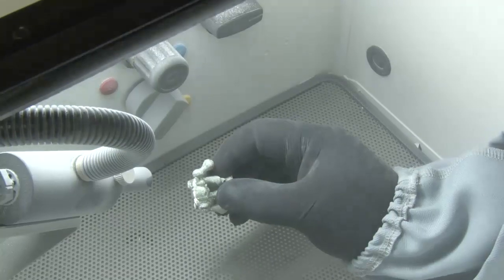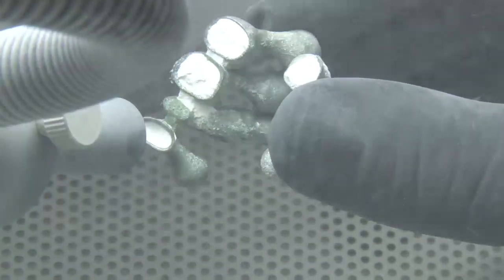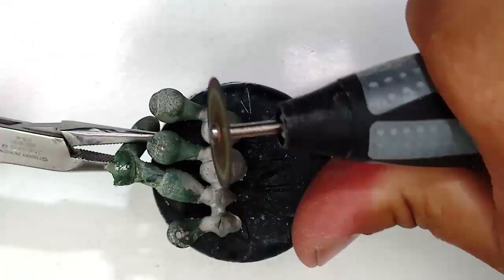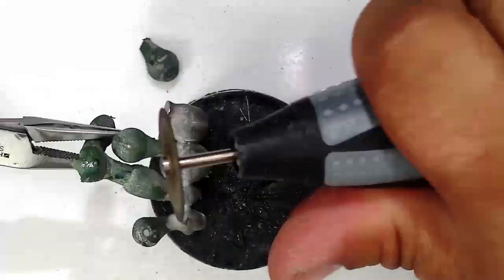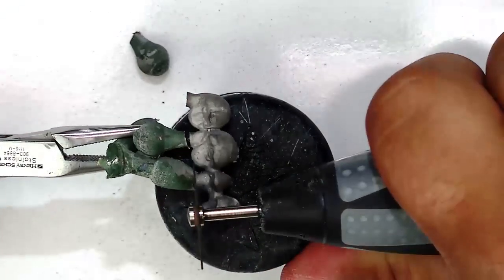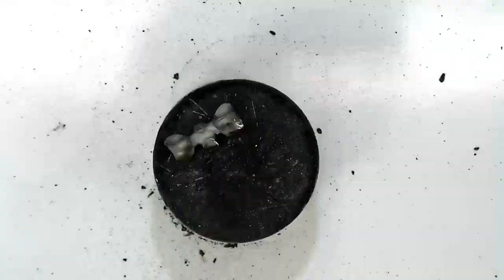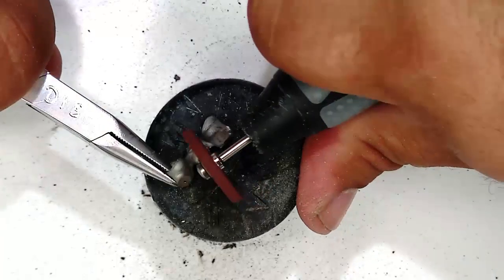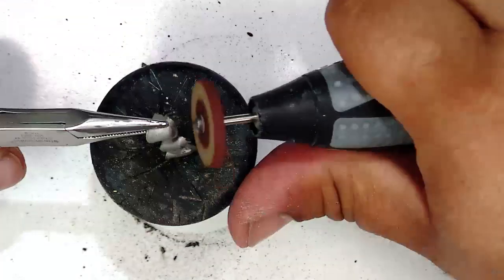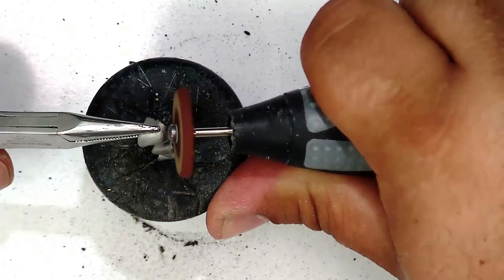This is then removed by sandblasting, as you can see here. Sandblasting has the additional task of removing the oxides on the surface of the metal. These can be seen here in green on the metal. Then the casting bulbs and the casting channels are removed. Projections are ground with a coarse large stone, and the restorations are finished.